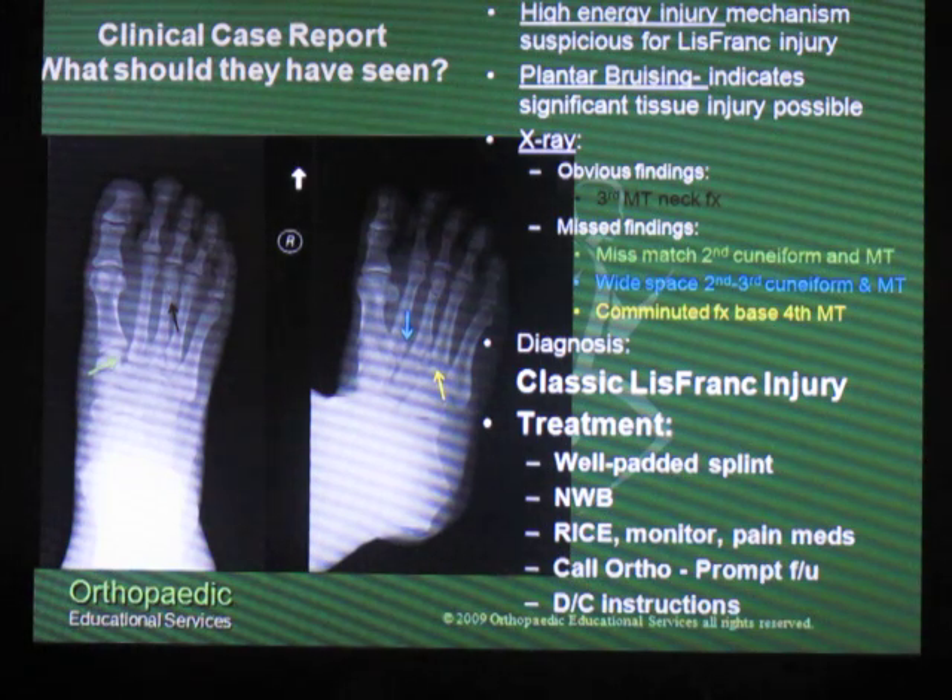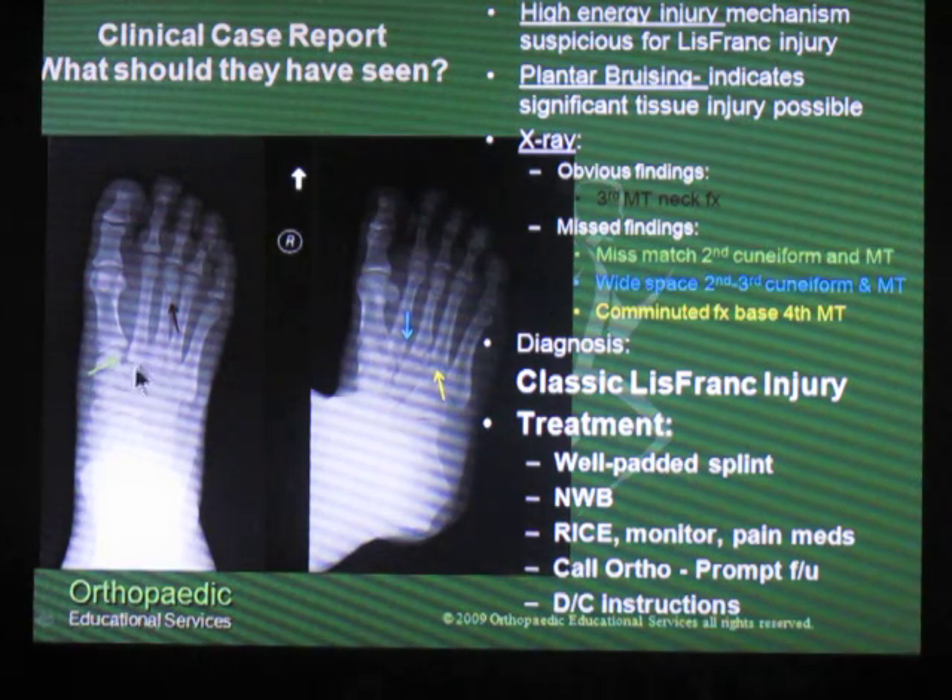So what should they have seen on x-ray? Well, first of all, they did have the third metatarsal shaft fracture, which you see here at the black arrow. The green arrow shows that they had a mismatch between the second metatarsal shaft and the second cuneiform — that's a giveaway for having a Lisfranc injury.